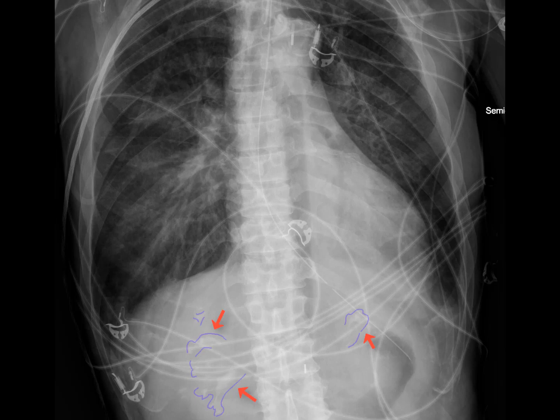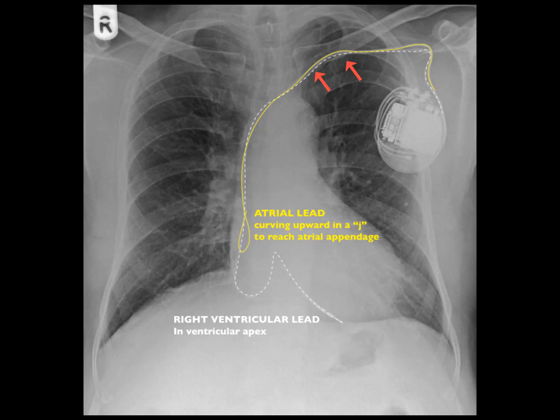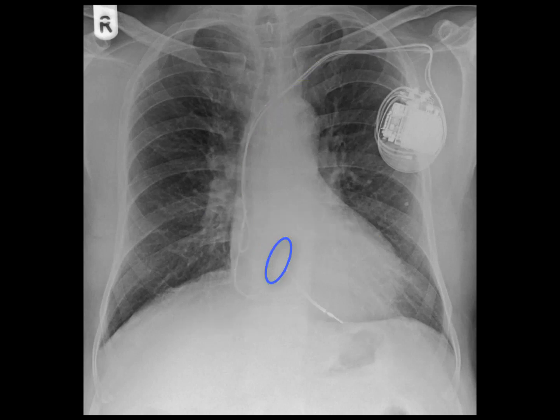Here we have a patient with a left chest dual lead pacemaker. The lead extends through the left subclavian vein, and one of the leads curls up into what is presumably the right atrial appendage, and the other extends through the tricuspid valve into the right ventricle.